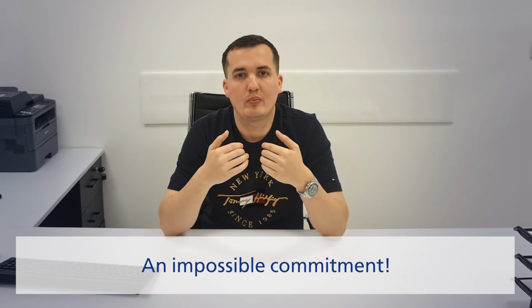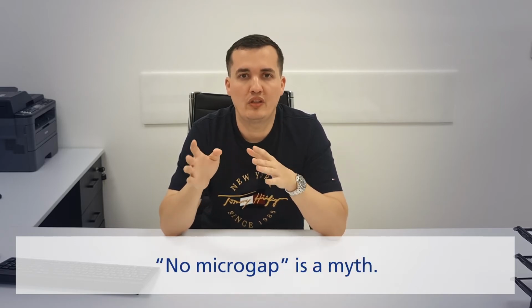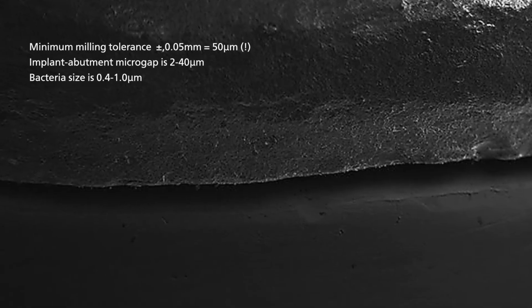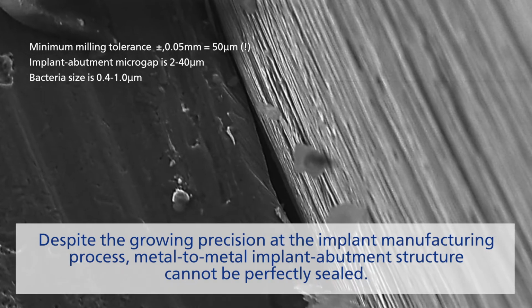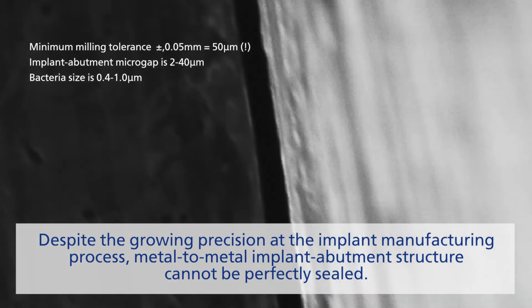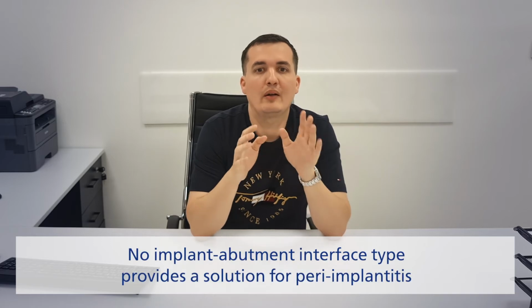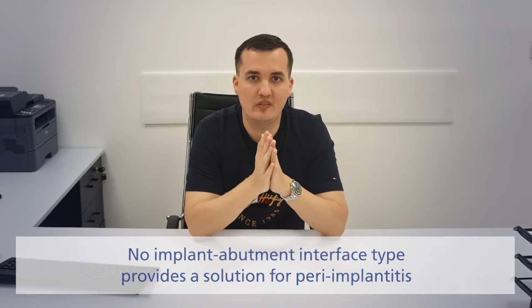As an implant manufacturer myself, let me tell you the truth. There is no such thing as no micro gap. When you go to a high enough resolution, and bacterial resolution is very high, you will always see the micro gaps between metal to metal connection. Bacteria will go inside no matter what. Micro gap and micro motion inevitably exist in any implant abutment interface. So we need to search for the solution elsewhere.